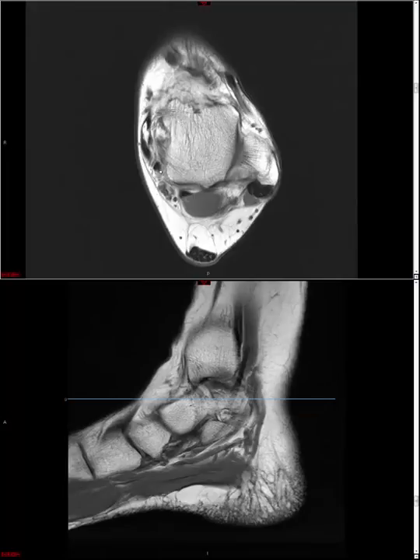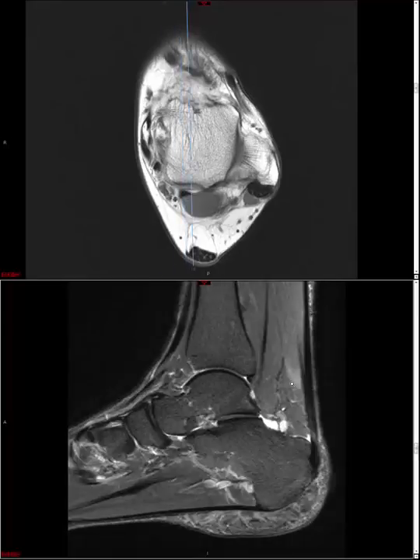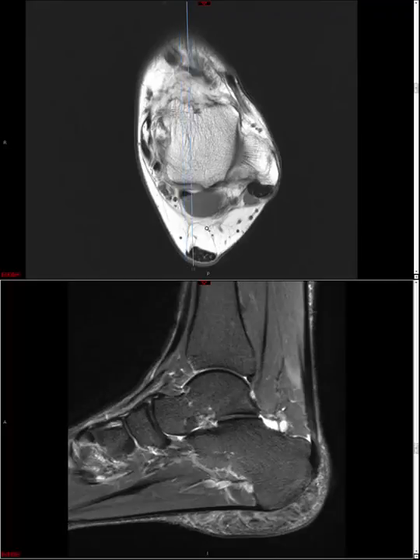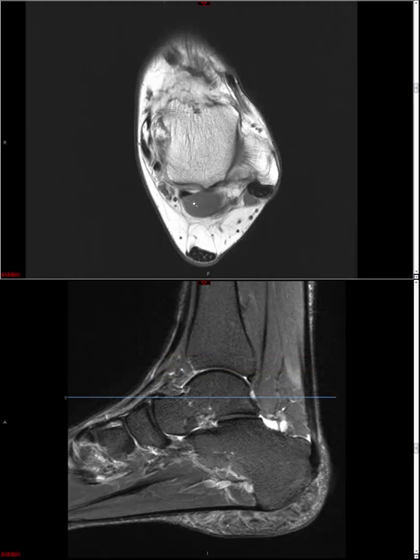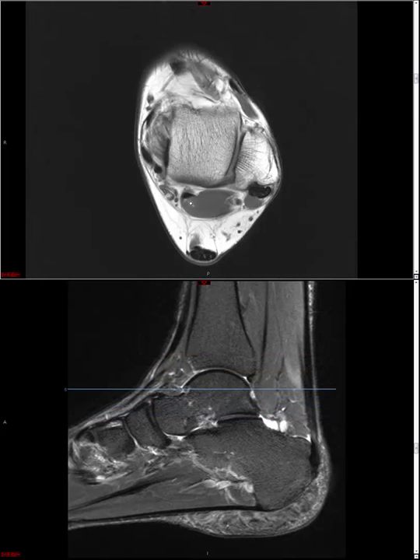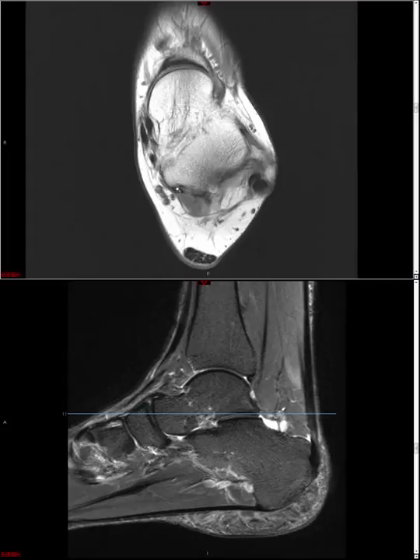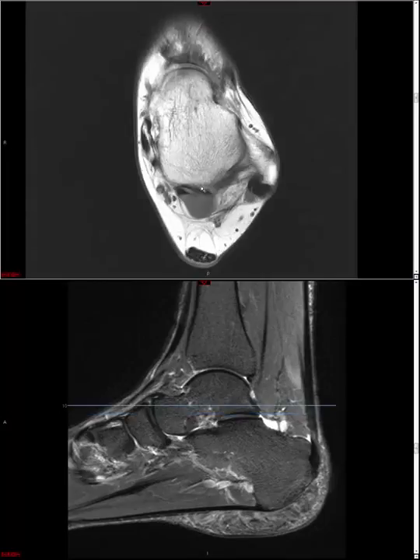Here are flexor digitorum longus and flexor hallucis longus. You may see fluid around flexor hallucis longus in the normal situation. It's important to note that in at least 20% of cases, the flexor hallucis longus tendon sheath communicates with the joint, so seeing fluid in the FHL tendon sheath does not necessarily represent a pathologic state. The flexor hallucis longus posterior to the talus insinuates through a groove formed between the lateral and medial tubercles of the posterior talus process.